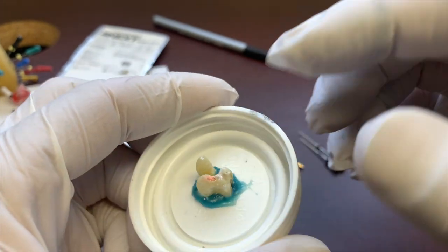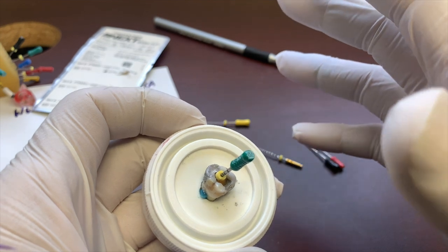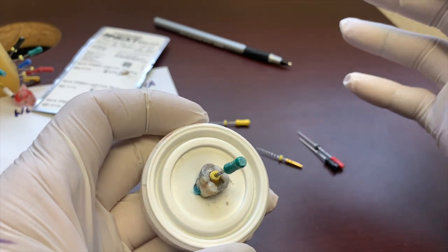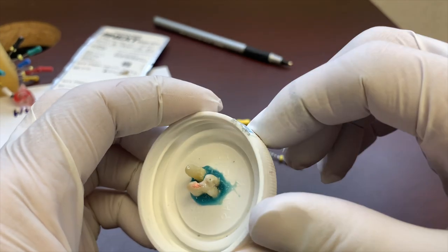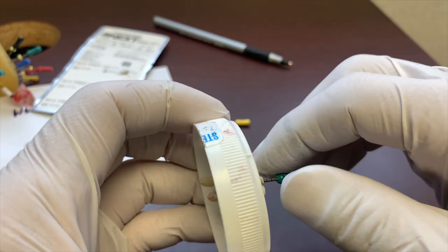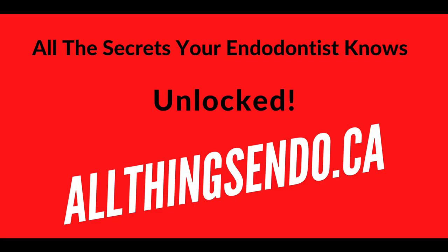We've debrided and removed as much biofilm as possible. So that in a nutshell is what I recommend, or what I've been doing for many years in terms of preparing large apical portions, large canals, when you run out of rotary files. Anyways, I hope that helps.